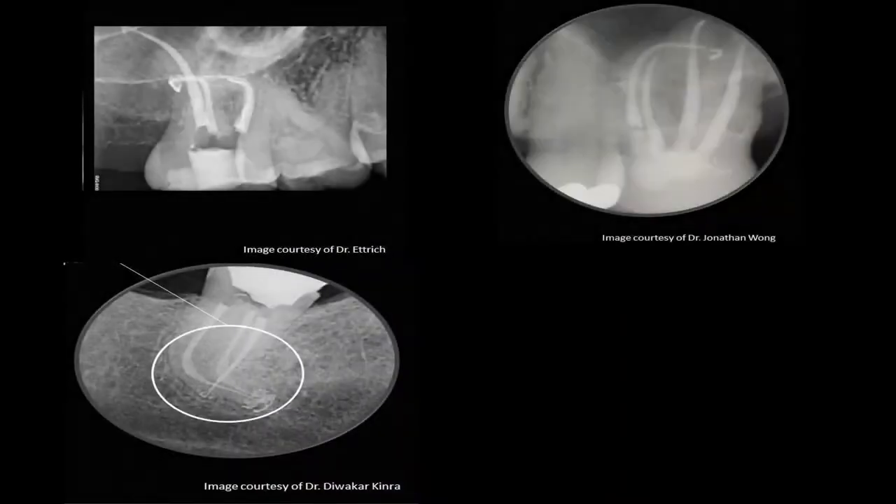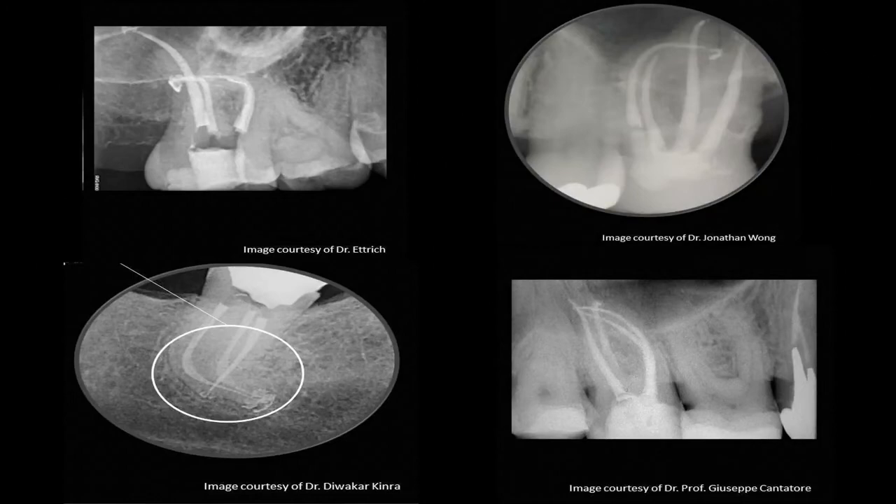As a recap, you've now seen how retreatment of gutta core is not an issue. If you can retreat gutta percha filled canals, then you can retreat gutta core. The same is not true for canals obturated with gutta percha and plastic carriers. As for obturating curved canals, the cases shown demonstrate how beautifully gutta core can obturate curved canals. Furthermore, post-space preparation of gutta core obturations is as easy as with traditional gutta percha obturations.